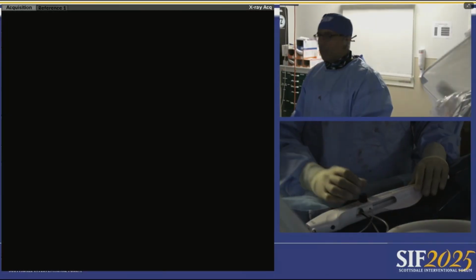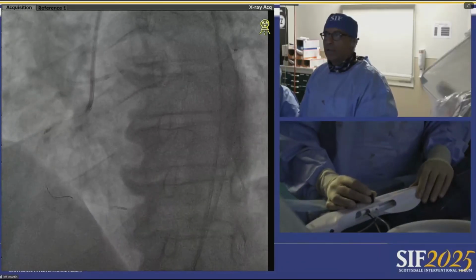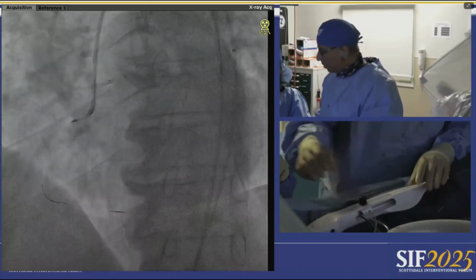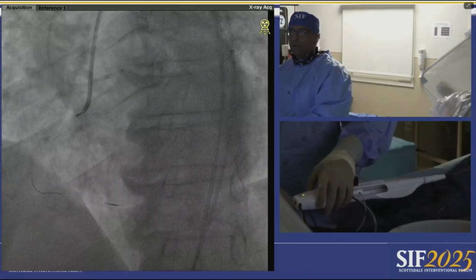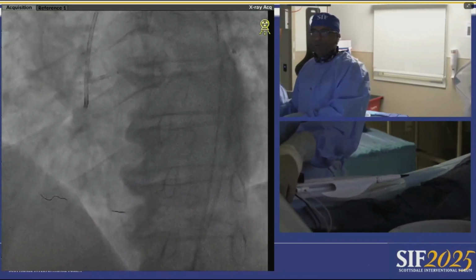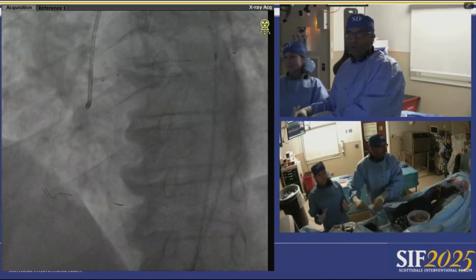So Mike, that was a quick run. Actually, let me go to Rebecca. So obviously, we've got a high-risk case going on at Honor. This was a distal left main with an RCA CTO, which would make it high risk. So do you want to talk about one got done with Impella, one got done without? What's the decision process? What are your thoughts about quote unquote protected PCI with hemodynamic support?